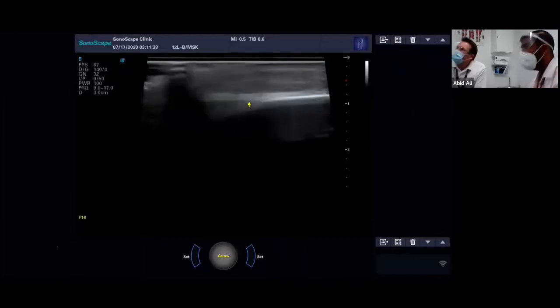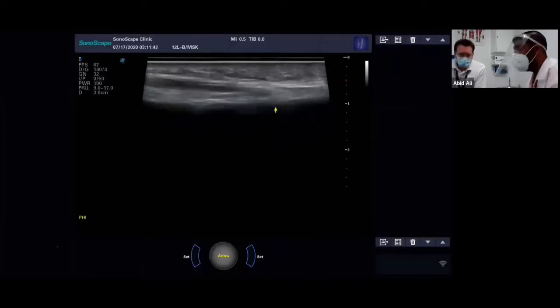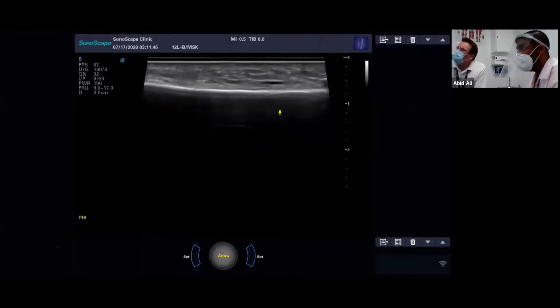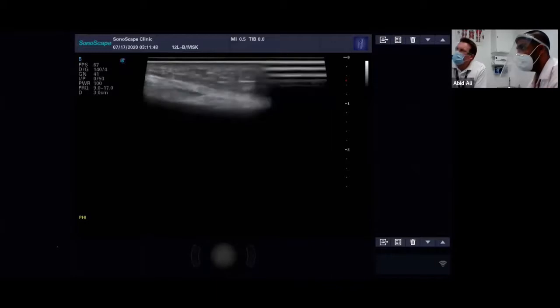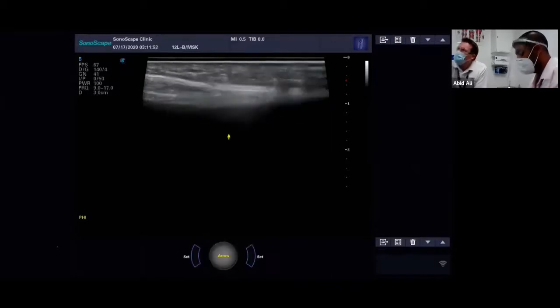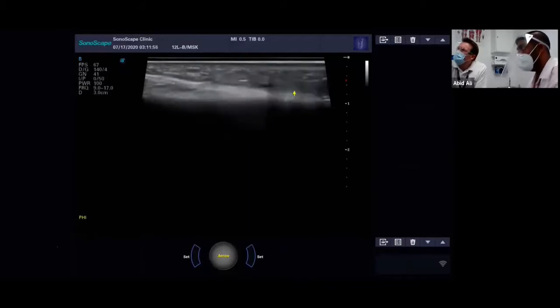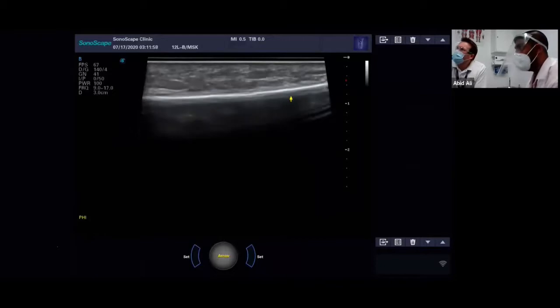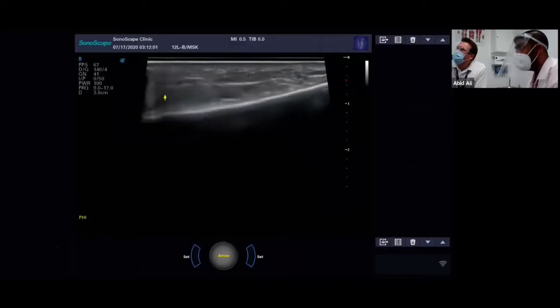So starting here, we're going to make sure we know where our probe orientation is there. So you want to make sure your marker's in the right place. So what I like to do is just rock the boat a little bit, and I can see that the right-hand side of the screen is the right-hand side of my probe. If I just demonstrate the other way, if my probe was the wrong way around, then I'd be lifting this end and I'm looking at the opposite end.